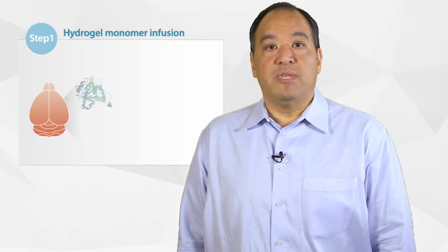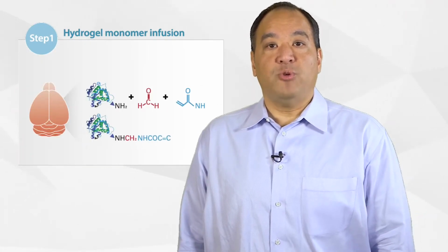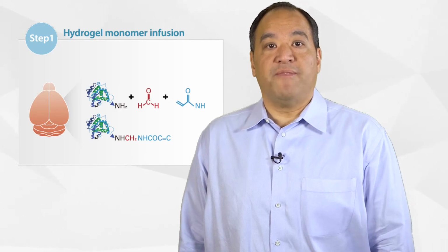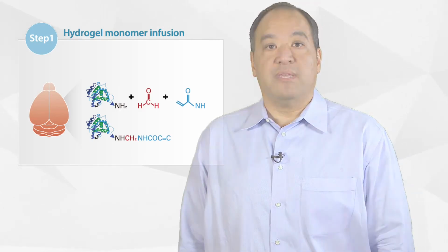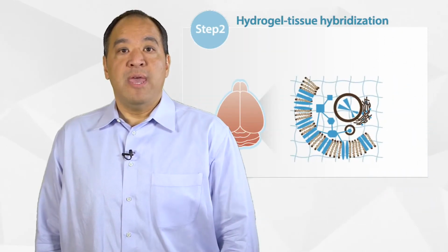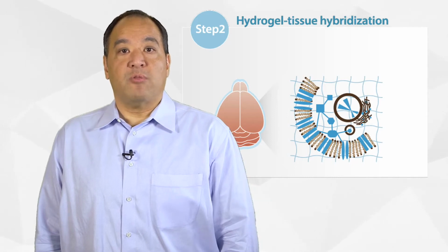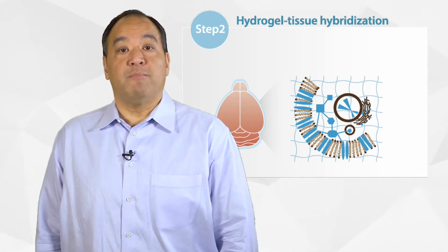Hydrogel cross-links secure biomolecules, making it possible to remove lipids from the tissue without disrupting its structure. CLARITY starts with a hydrogel monomer infusion into the tissue of interest. The tissue sample is incubated in a hydrogel solution to enable complete diffusion of the hydrogel into the tissue. After the tissue sample is fully infused with hydrogel, it's polymerized, which then cross-links biomolecules into their location to completely preserve the molecular structure of the tissue. After polymerization is complete, lipids are removed from the tissue to clarify it.